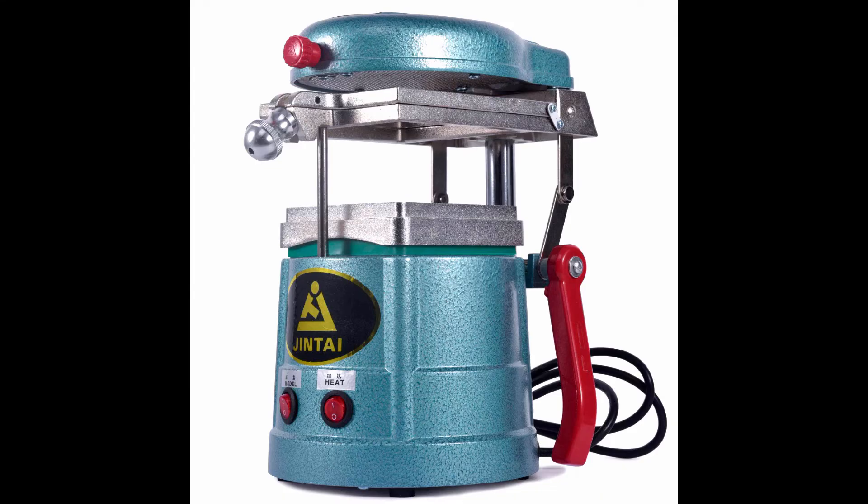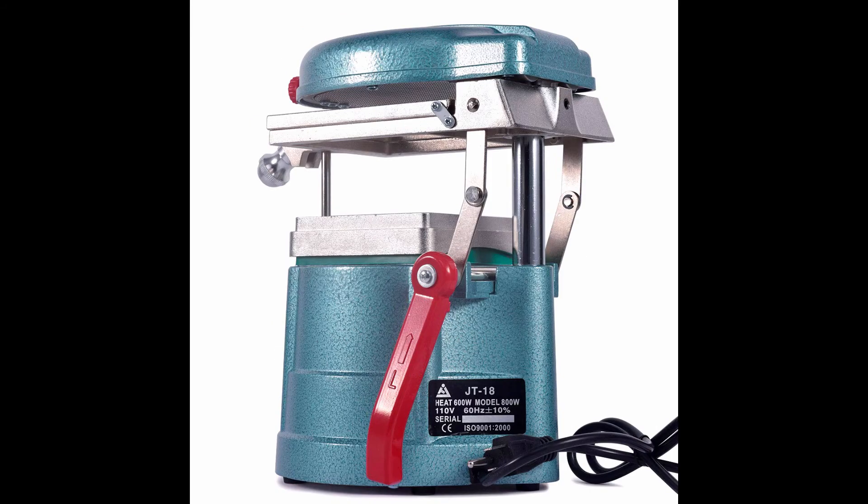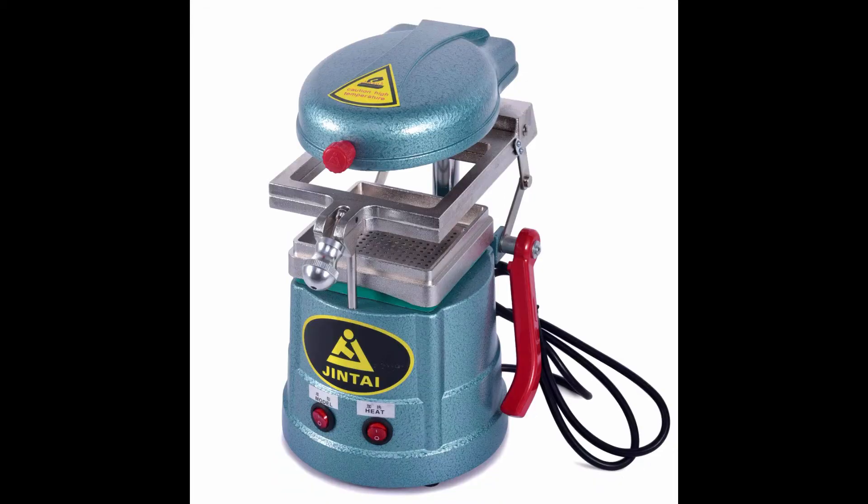Dental Vacuum Forming Machine — Laboratory Heat Molding Equipment. Heavy duty vacuum motor provides precise downward suction. Features a symmetrical heating system ensuring uniform heat distribution. Adjustable, rust-resistant body accommodates various materials. Non-rotating sliding frame makes operation easy and stress-free.